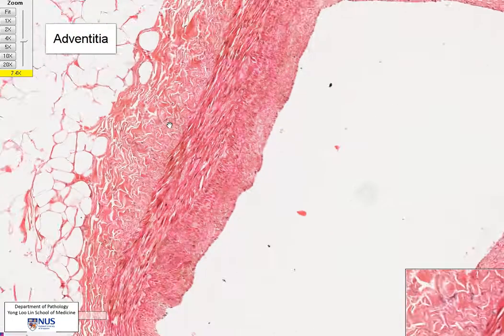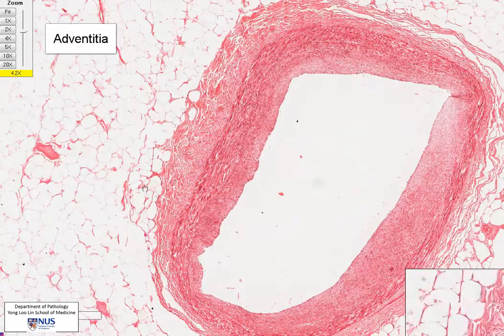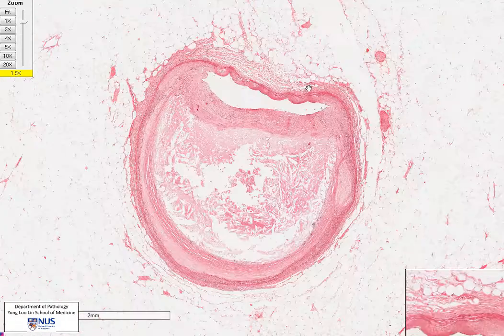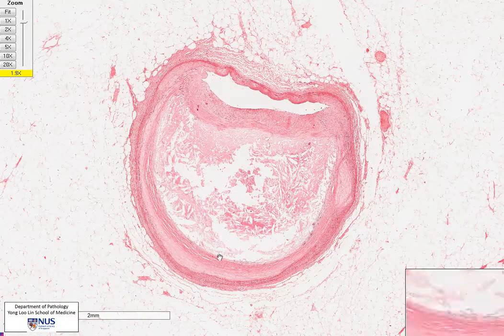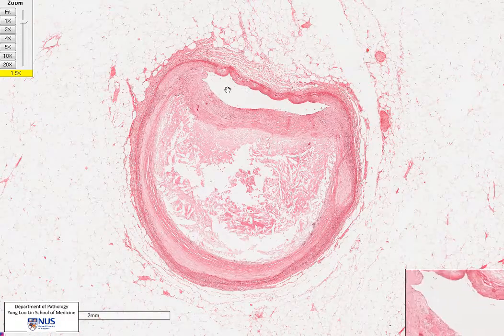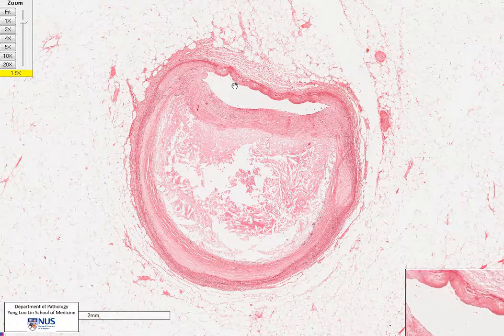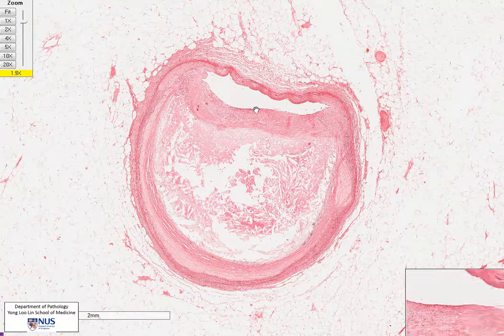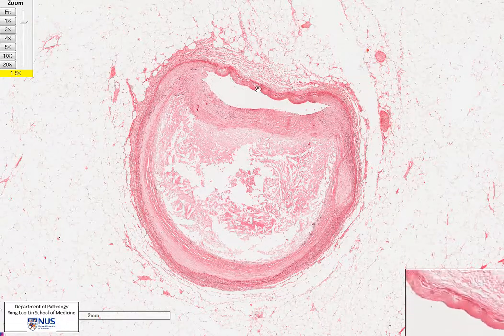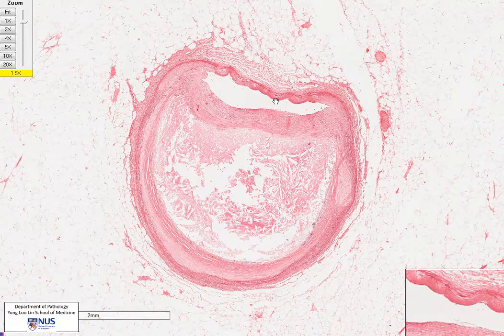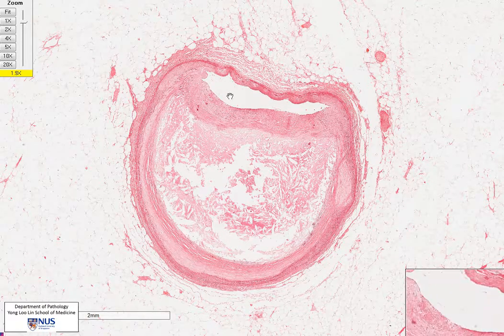Now let's move on to look at an abnormal vessel. Here is a coronary artery that is obviously very abnormal. The lumen has actually been compressed almost to a slit-like opening over here.